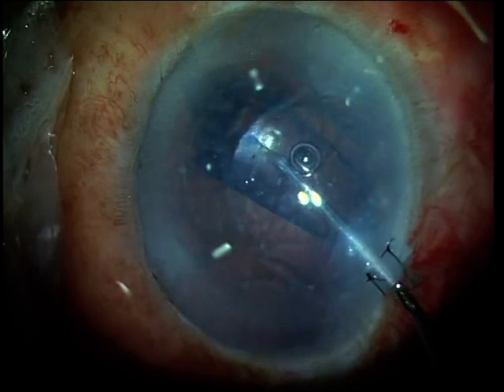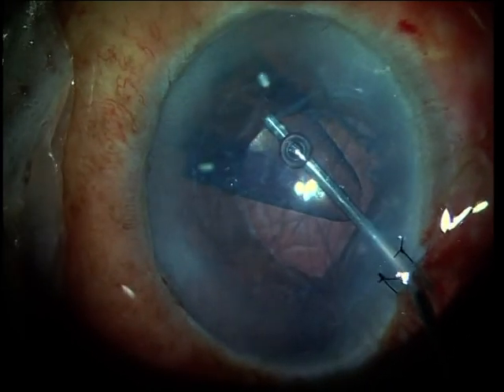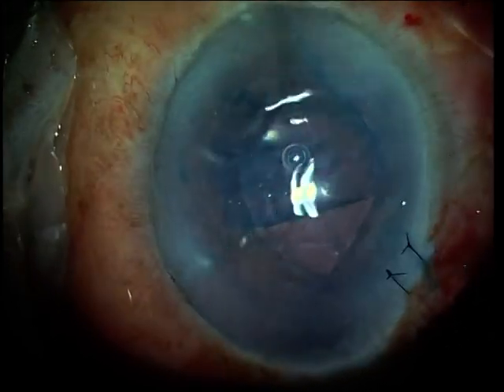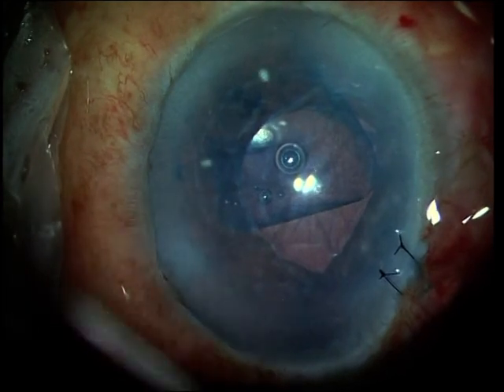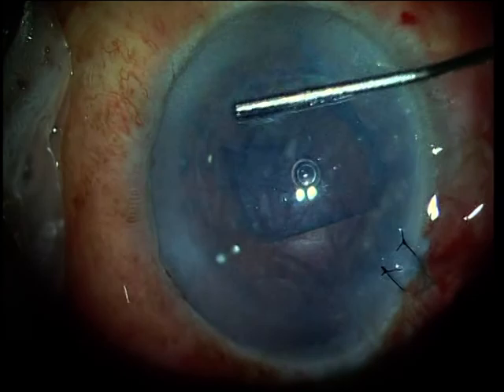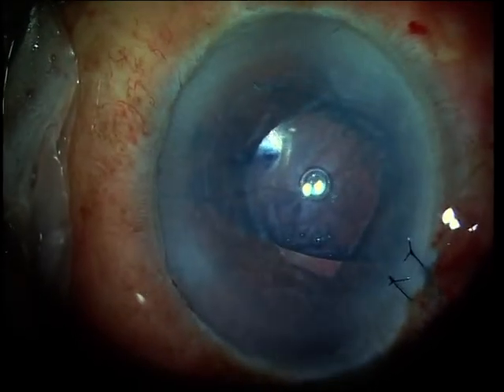The graft is unrolled using saline in a cannula. Saline is injected slowly between the recipient and the graft so that it unrolls smoothly. Stroking the cornea from above over the graft also helps unroll the rolled-up margins of the Descemet's membrane.